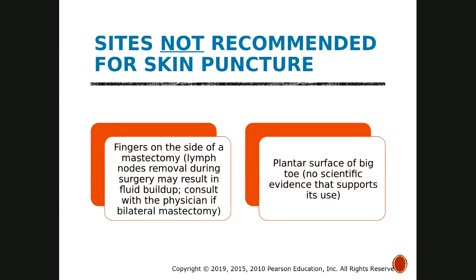Fingers on the side of a mastectomy. Lymph node removal during the surgery may result in fluid buildup. Consult with a physician if it's a bilateral mastectomy. Generally, it doesn't matter the length of time. It could be 10 years, it could be 50 years. If it is a bilateral mastectomy, we do need an order for a foot draw from the physician. We cannot use the big toe. There's no clinically significant scientific evidence that supports its use.